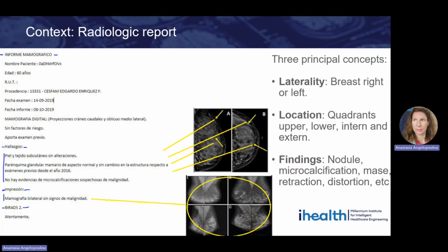This is the anomaly: a nodule, microcalcifications, mass, retraction, and so on.